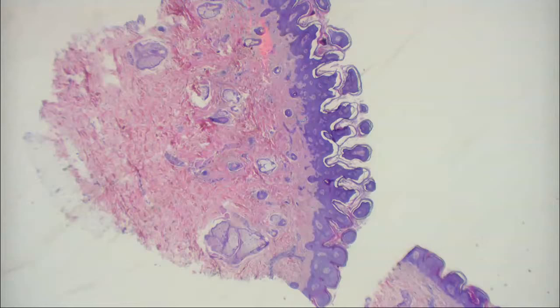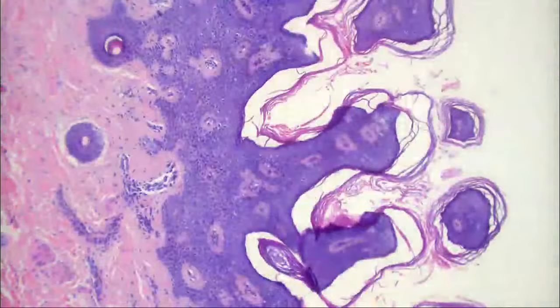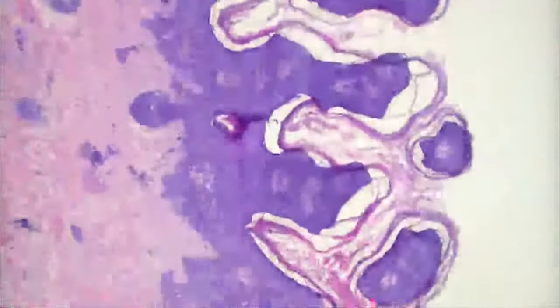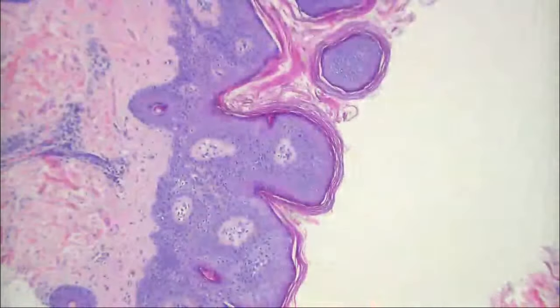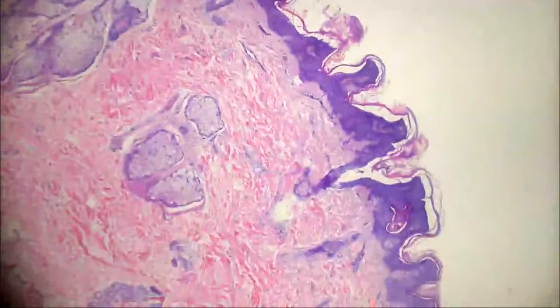And notice this one isn't as digitated as the other one. It's a little bit more gentle papillomatous than the other one. It doesn't have the very thick cornified layer that the carp had. It doesn't really have any pityrosporum, well, it might have some in here, but it's not really caused by the pityrosporum like the other one is. So what do you think about in that list that you had before that can also give you epidermal mostly proliferative change like this? So I was thinking about, when I initially looked at this, seborrheic keratosis.